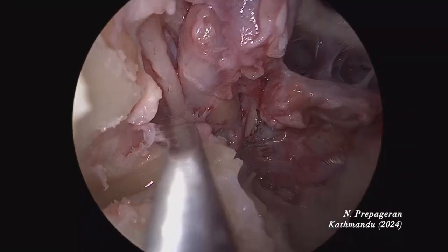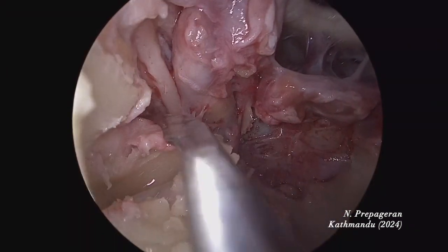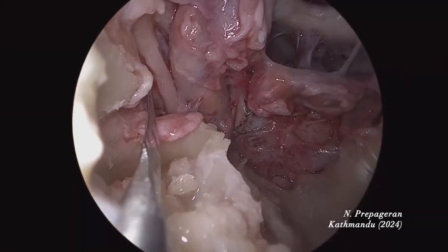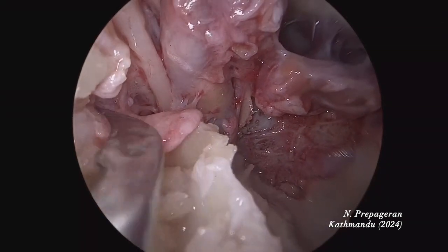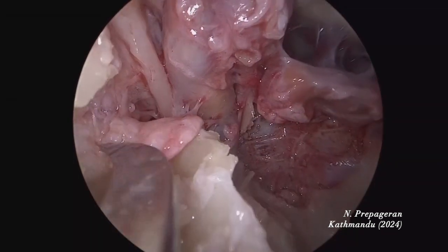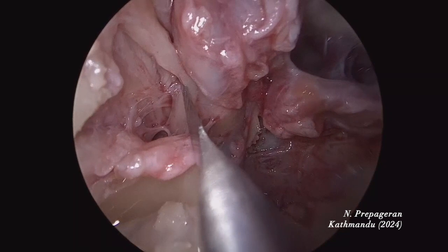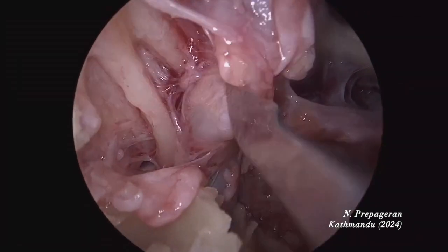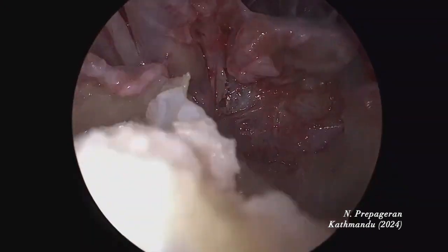Let me open the V2 for you. Can you see V2? Coming from the cavernous sinus: V2, V1, V1 and V2. Sixth cranial nerve. This is your cavernous sinus. We will do the same on the opposite side because Meckel's cave is exposed there.